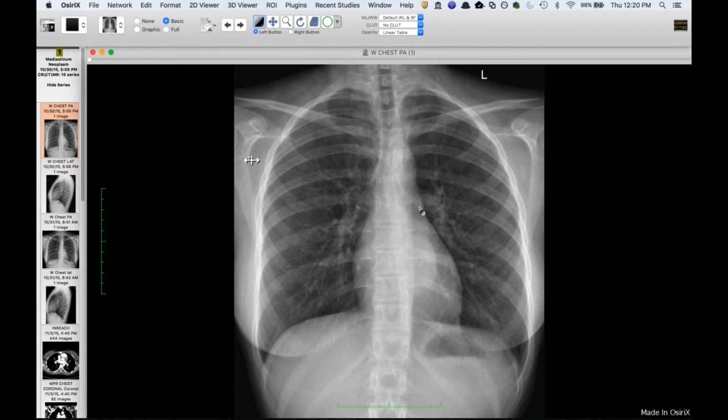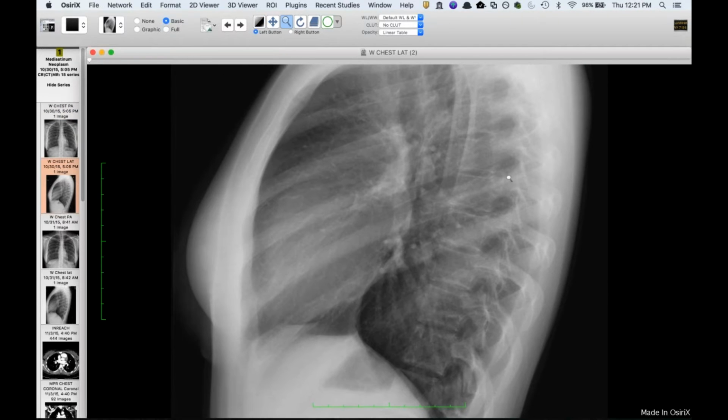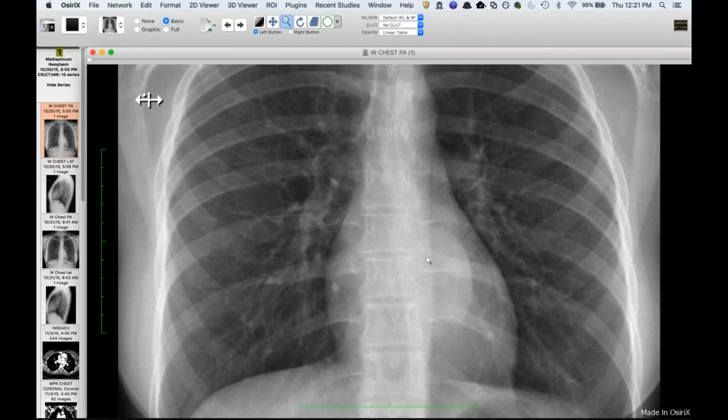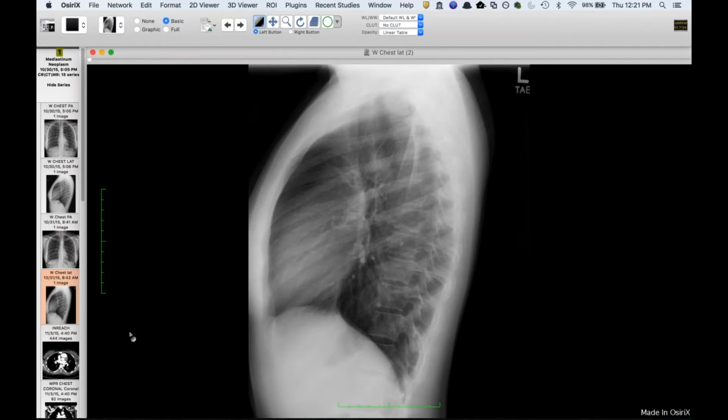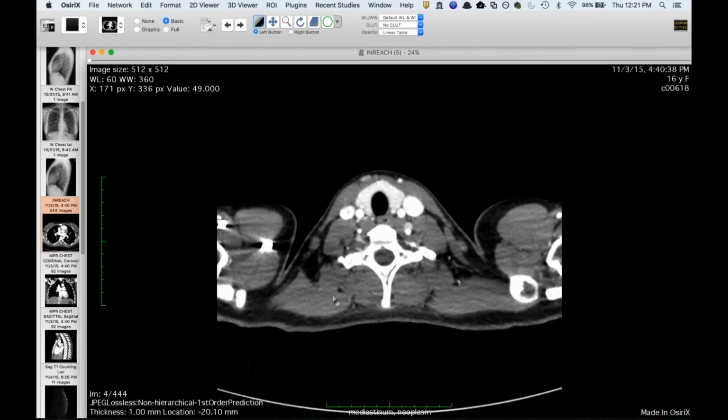Great. These next two are related, and this is a young girl. She's 16, I think, or 17, and had this chest radiograph for cough at an outside hospital, and they astutely picked up this abnormal opacity projecting over the heart on the PA view. It is pretty surprising that there's not really any clue on the lateral. It certainly doesn't look like it's anterior mediastinum, and it's not really obscuring the descending aortic stripe. Maybe a touch there. But she had two radiographs, and you don't really see anything on the lateral view pointing to where it actually turns out to be, because this is a posterior mediastinal mass.